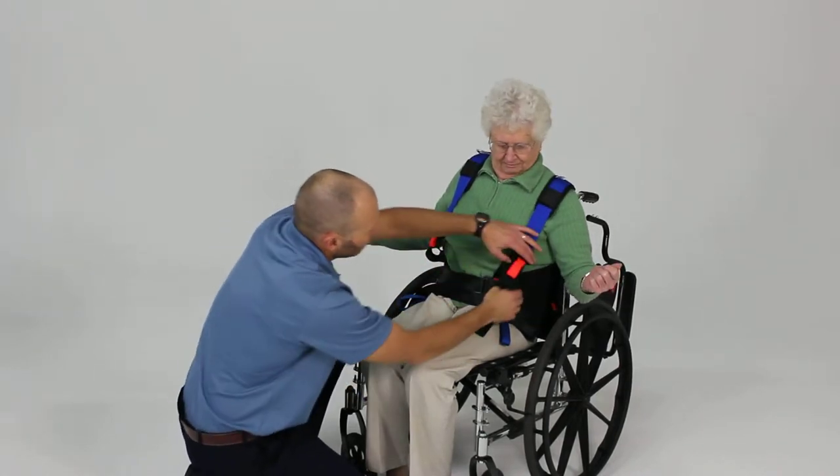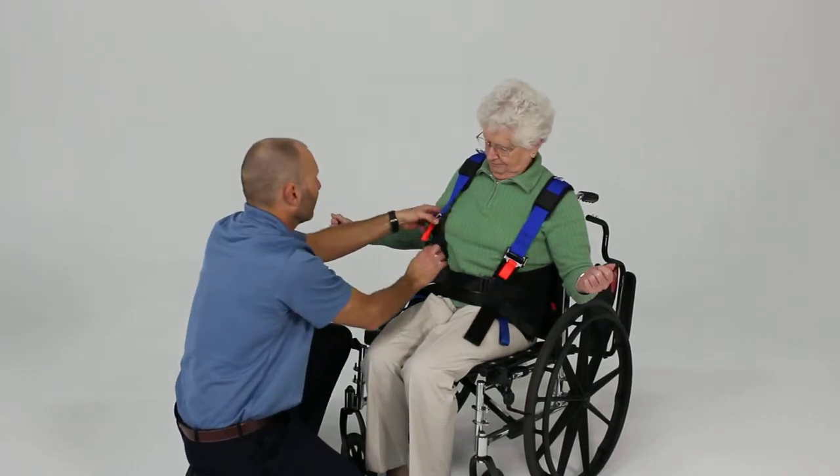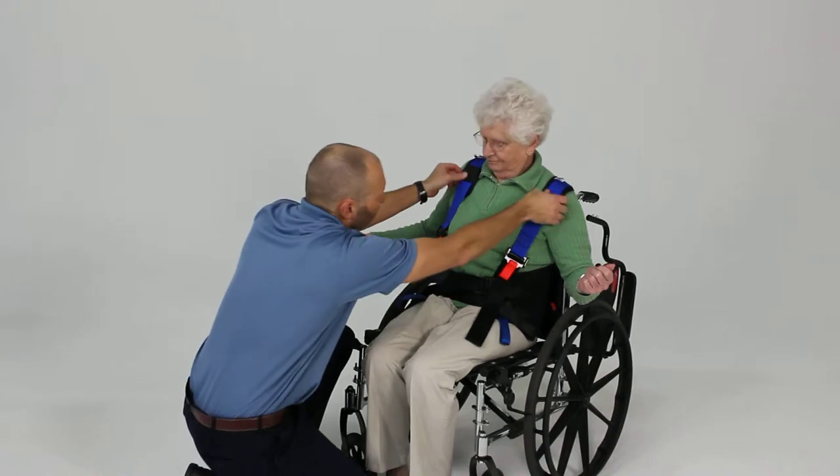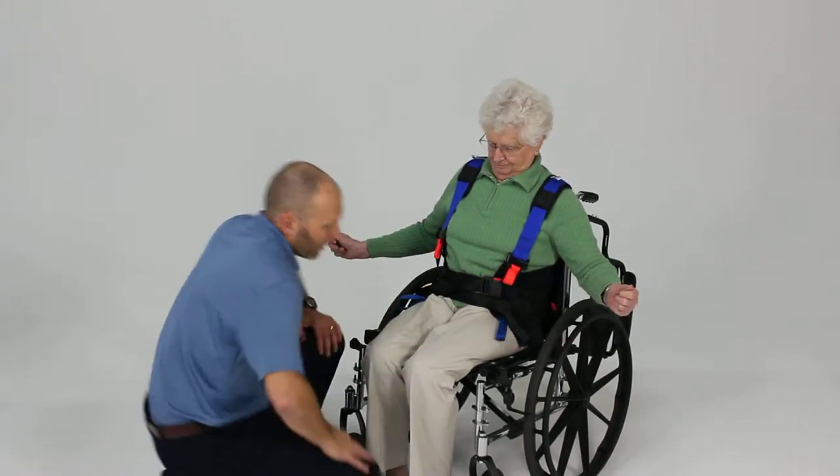Go ahead and take up the slack in the shoulder straps so those don't fall off the shoulders, and now we're going to apply our lower piece.